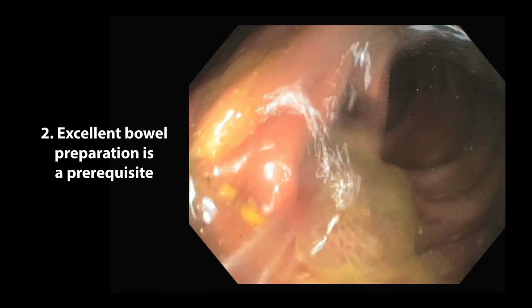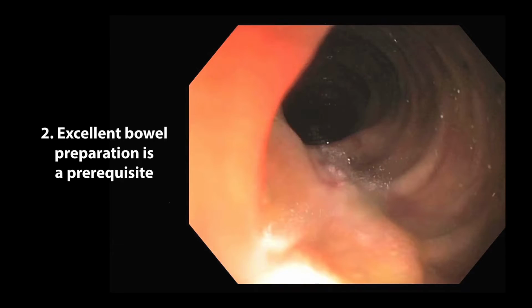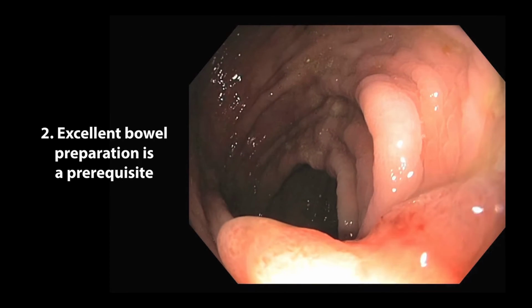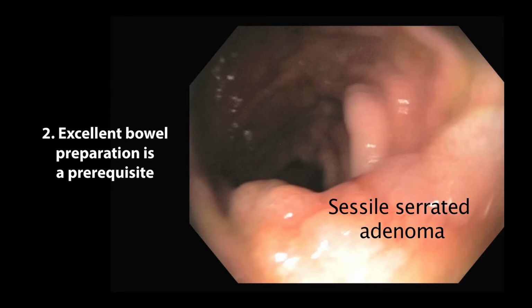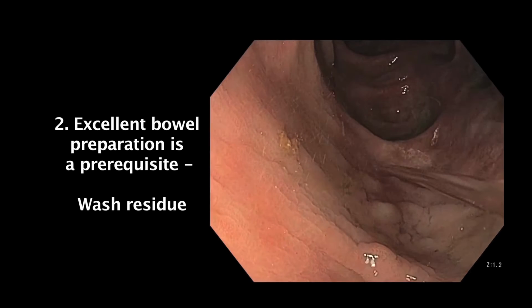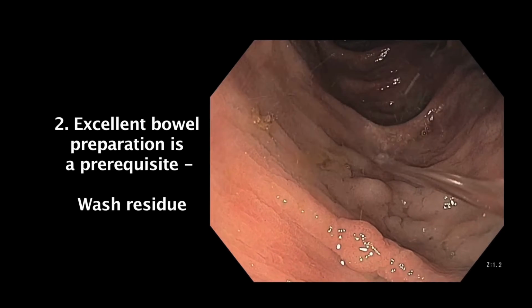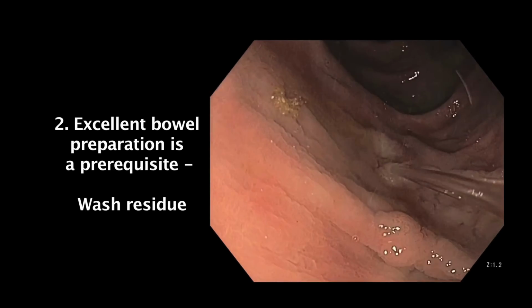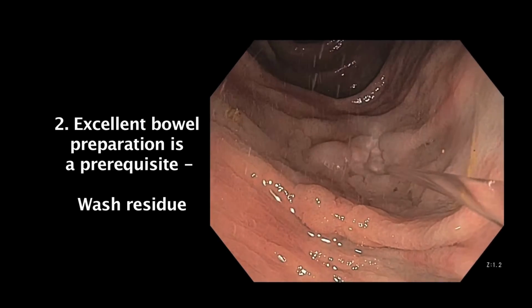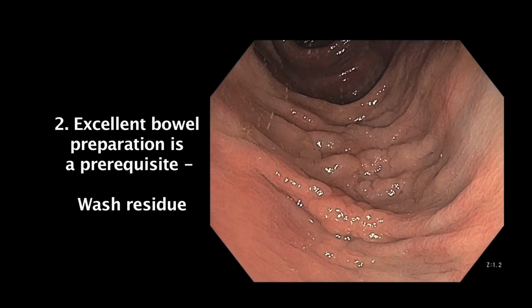Patients should prepare for colonoscopy using the split-dose bowel preparation. Excellent bowel preparation quality is imperative for optimal screening. Focus on the importance of bowel preparation quality cannot be overemphasized. Irrigate the colon during intubation. Any remaining residue should be meticulously washed and suctioned prior to the application of chromoendoscopy. When the blue dye mixes with the bilious stool, it turns green.